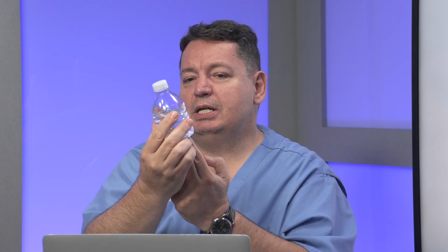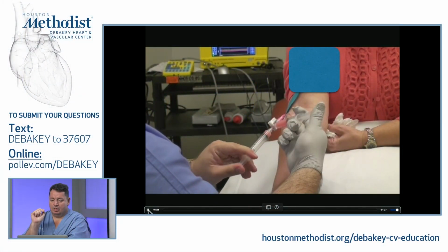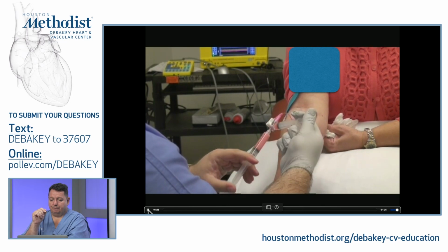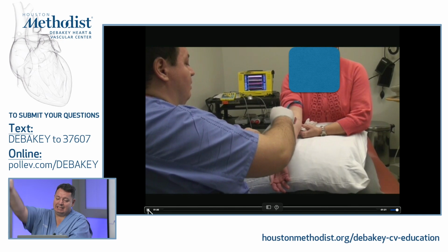So when you are pointing upwards, you definitely will flush in your bubbles, and then you follow with a saline flush. Okay, so here comes the video. Agitated about 10 times. Beautiful bubbles. Okay, now zoom out, please. We already practiced how to do Valsalva. Injection is in. Asking to lift the arm up.